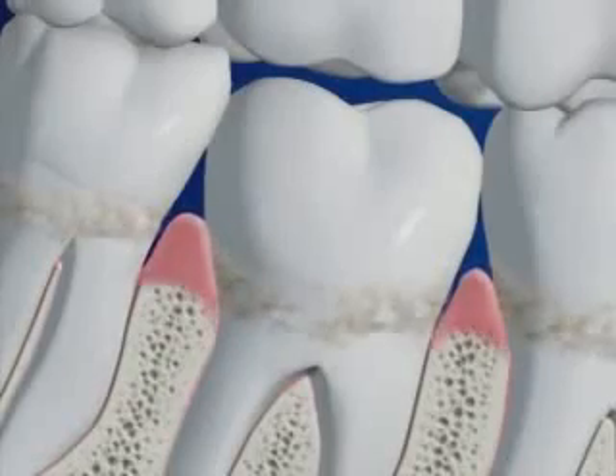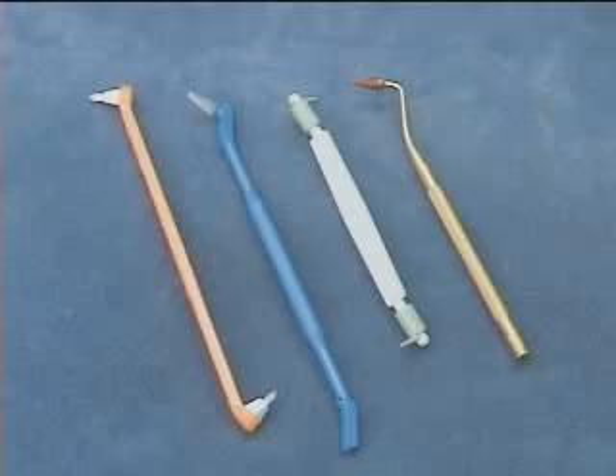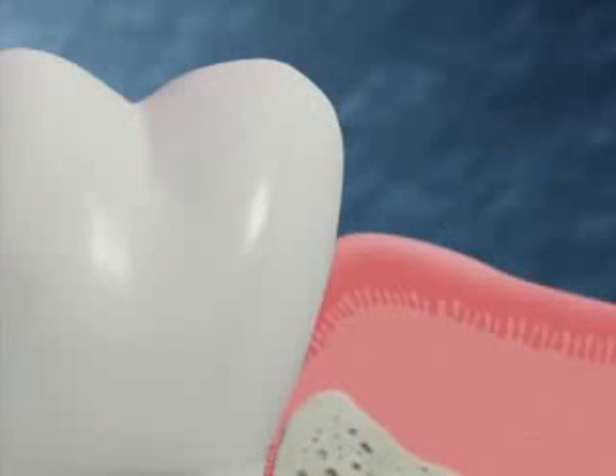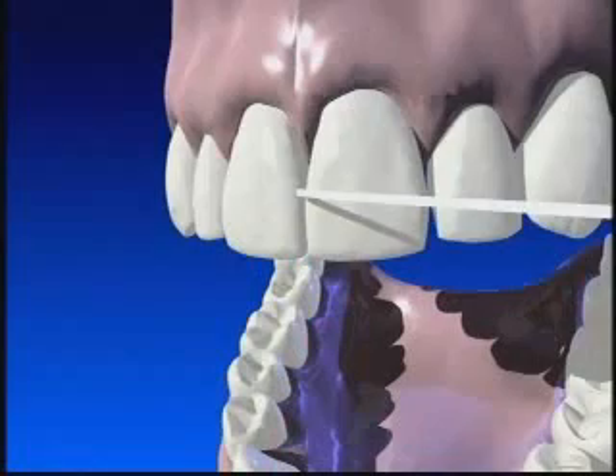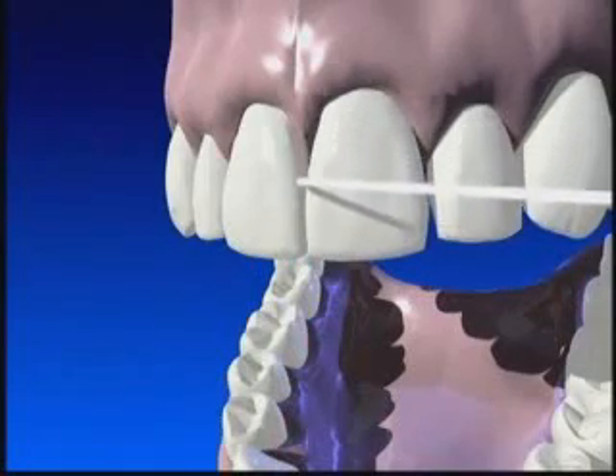When you've lost bone due to periodontal disease, it takes new tools and techniques to clean the plaque off of your teeth. In a healthy mouth, the space between the tooth and gums called the sulcus is normally two to three millimeters deep, and that's how far below the gums you can effectively clean with a toothbrush and floss.